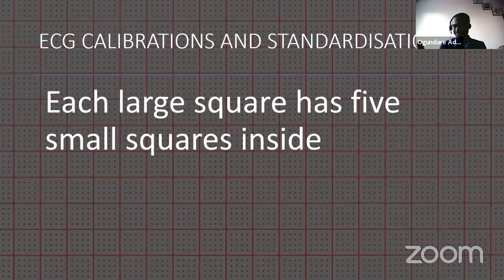So how many millimeter would a small square be, if a large square is 5 millimeter and has a further 5 smaller squares inside?